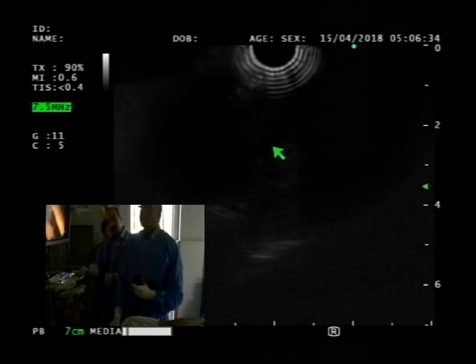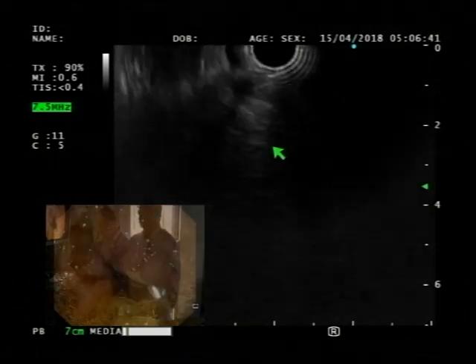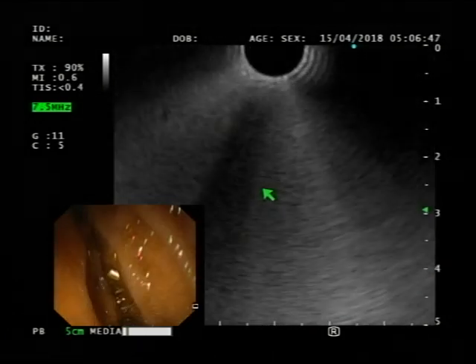Right. So now you reduce. Just Dr. Mustafa, ERCP, can you hear us? Yes. Can you just please brighten the picture? We're seeing a very dark picture here. Right now we don't have much, but sure, I can generally brighten it. Yeah, there's a stand. Sorry.